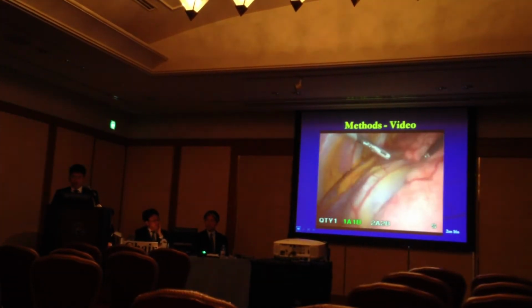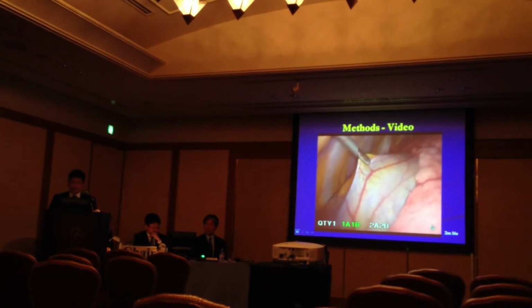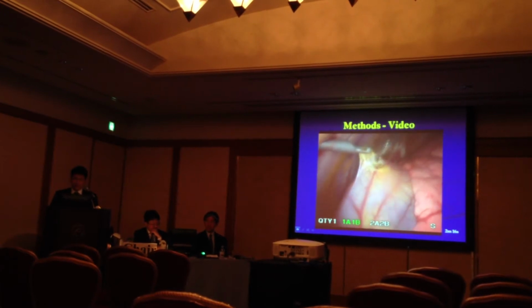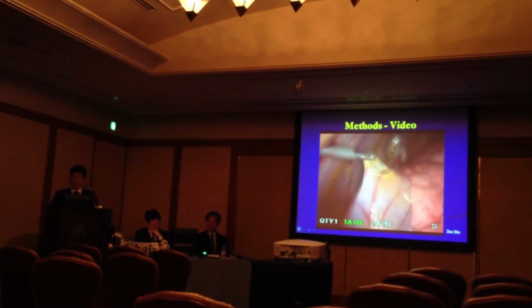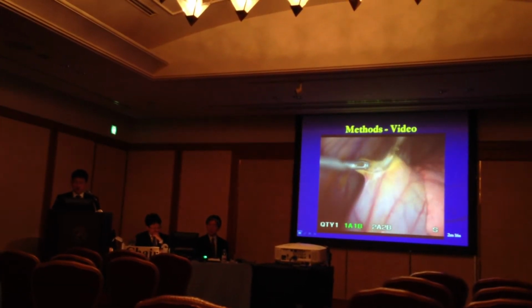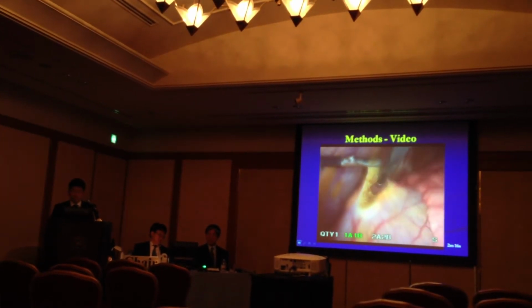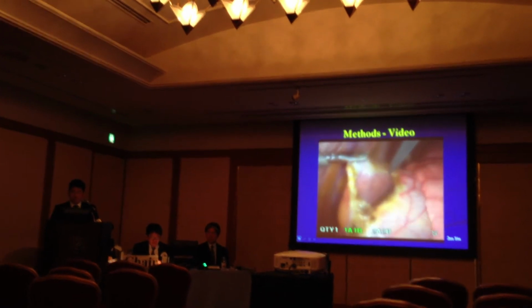So with the 3 mm instruments, we can push the lung posteriorly and get it away from the pericardium. The pericardium is breached, and we can make a small hole in the pericardium. You can see the fluid level in the lower part of the video, within the pericardial space. The 3 mm instruments are obviously very sharp. An endosucker is used to collect and save the pericardial effusion for analysis, and for improved drainage of the effusion to facilitate further dissection of the window. The endohook diathermy can also be used to expedite the dissection.